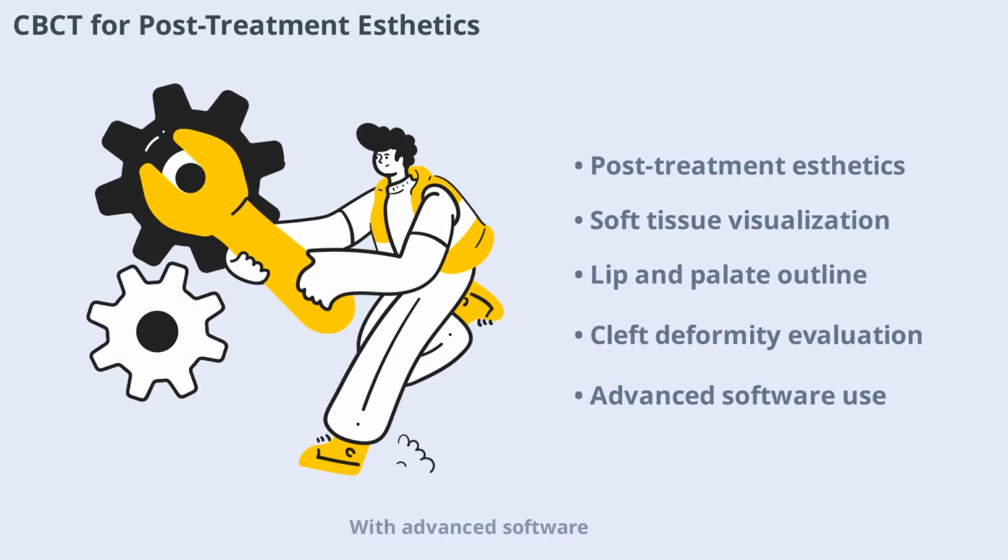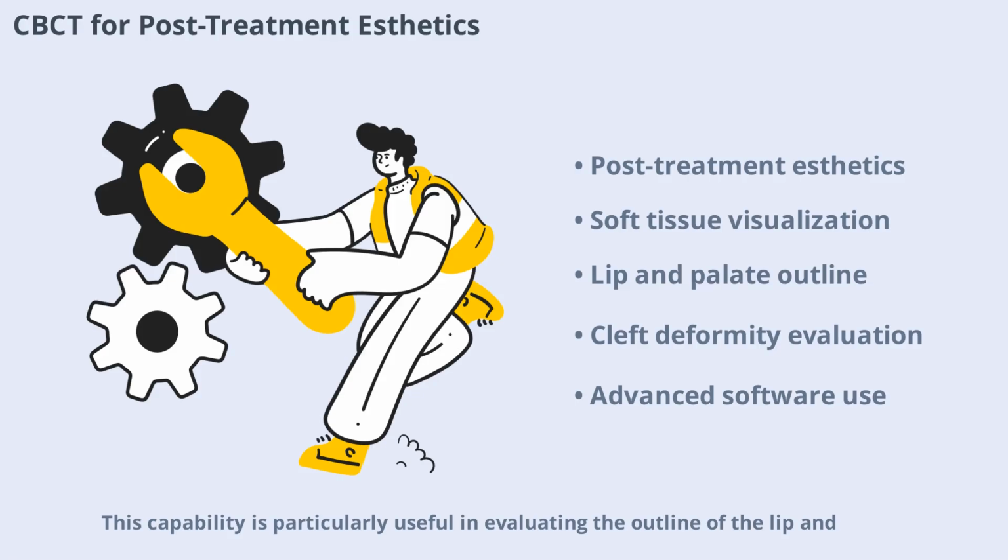With advanced software, CBCT allows for post-visualization of soft tissue, helping clinicians appreciate post-treatment aesthetics. This capability is particularly useful in evaluating the outline of the lip and bony regions of the palate in cases of cleft lip and palate deformities.